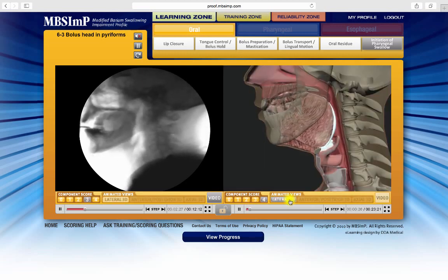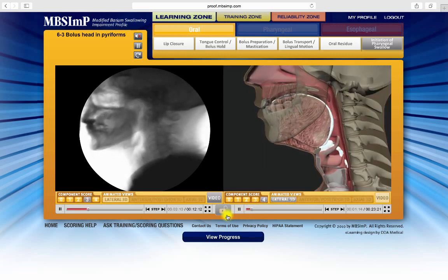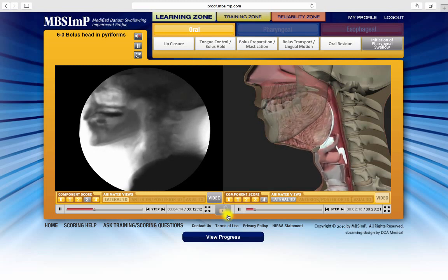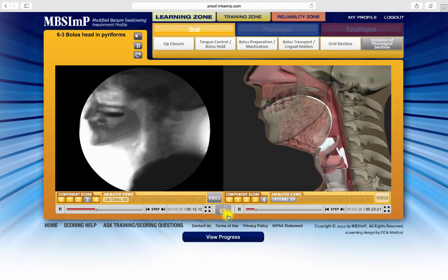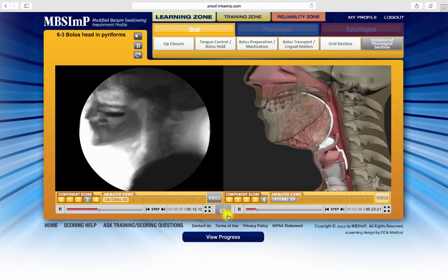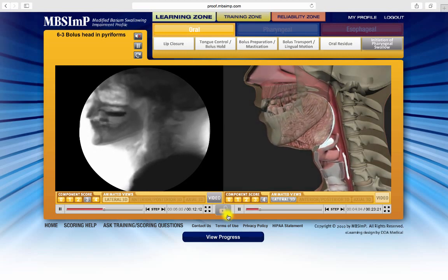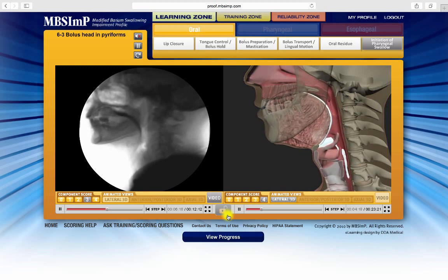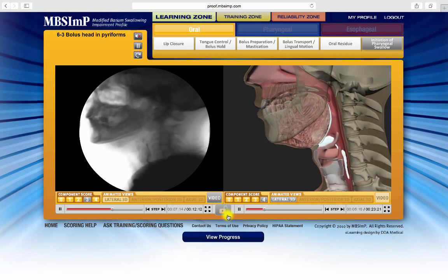Notice the padlock icon here. It appears unlocked, indicating that the unlocked mode is active. The unlocked mode is necessary for comparing two different scores.